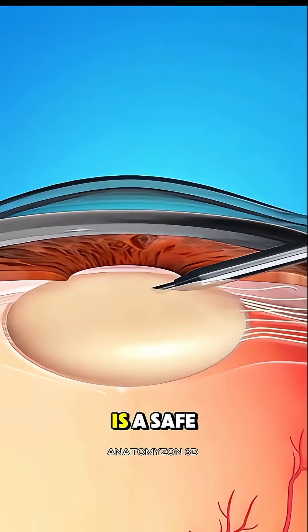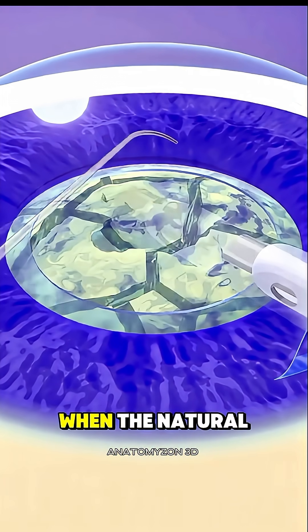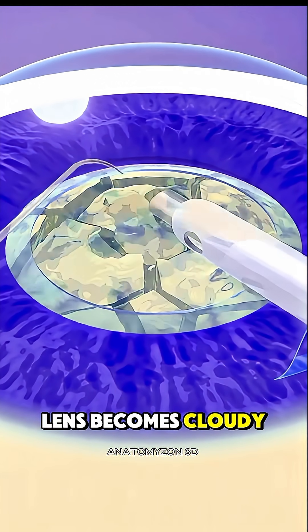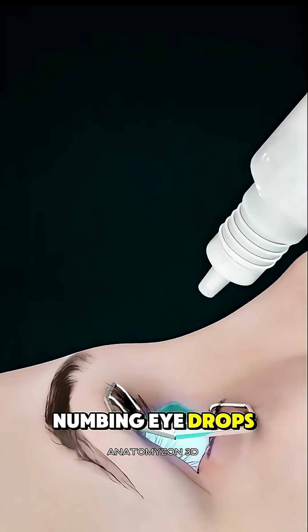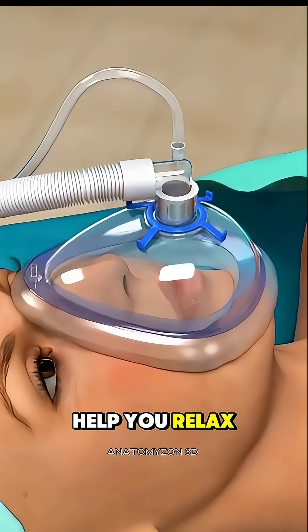Cataract eye surgery is a safe and common procedure used to restore clear vision when the natural lens becomes cloudy. It begins with numbing eye drops to keep you comfortable and sometimes a mild sedative to help you relax.